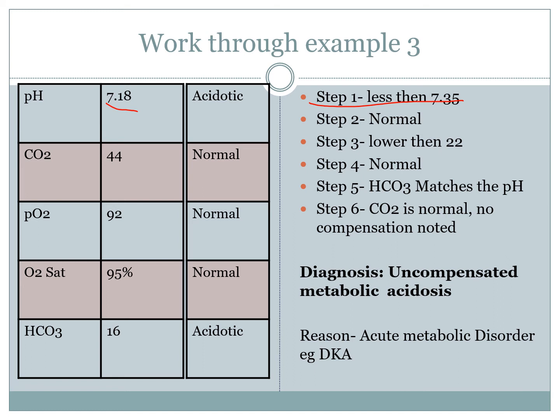Looking at step 2, CO2, 44. Okay, it's normal. It's on the higher end of normal, but it is still normal. The bicarbonate levels are sitting all the way down there at 16. So therefore less than 22, so that gives it an acidotic value.